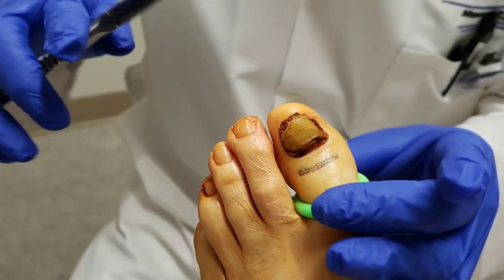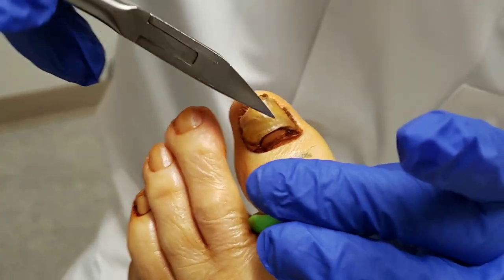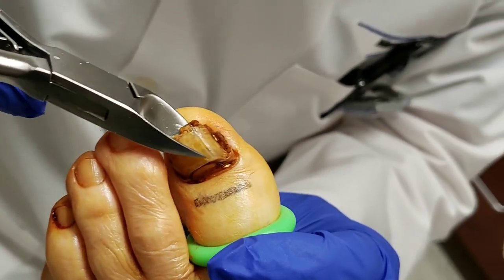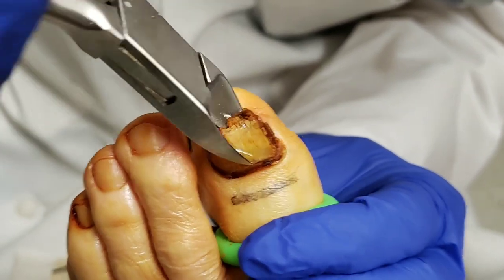For a nail avulsion, basically you just want to free it up. This one is pretty loose anyway. So what you do is when you grab it, you just twist. Any pain? No. Okay. And you just kind of free it up.